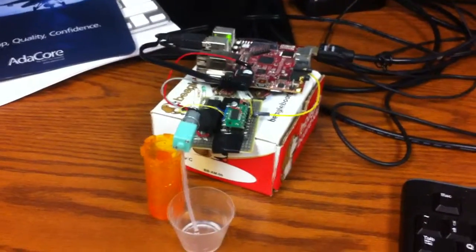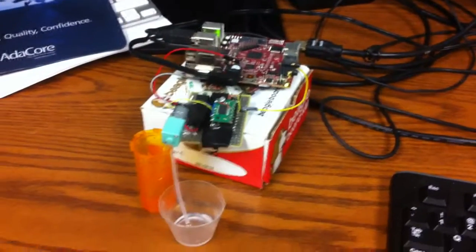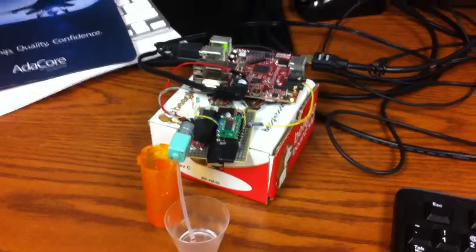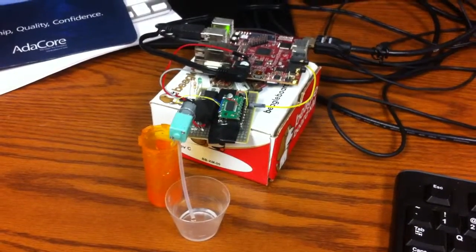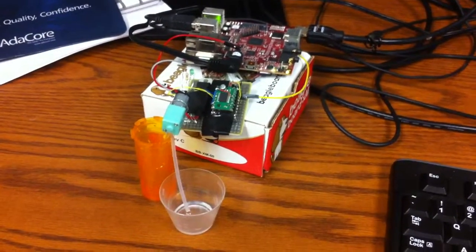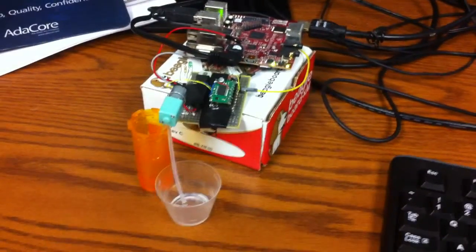In this demo, I would like to present a PCA infusion pump prototype created by me. A PCA pump is a medical device which is usually used after surgery to deliver medication into the patient's vein. The medication is usually painkillers such as morphine.